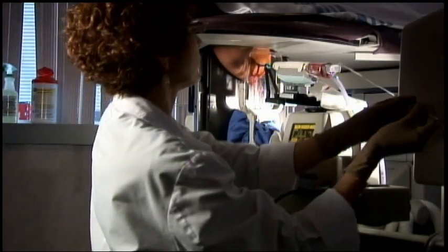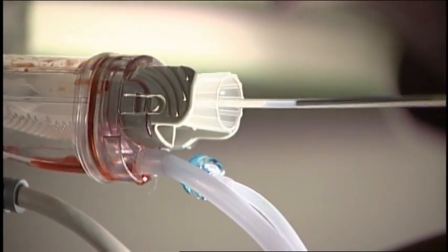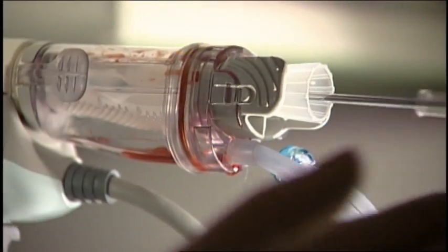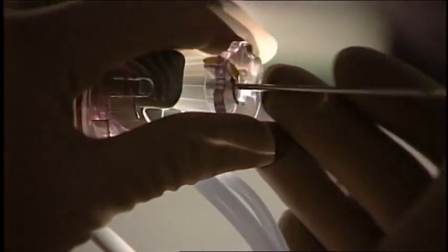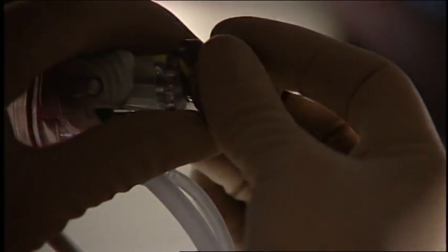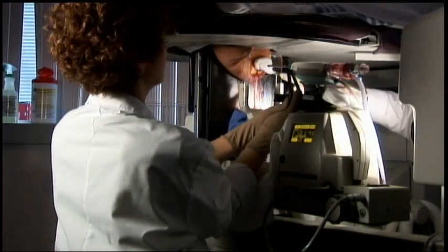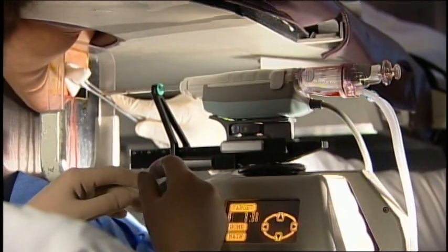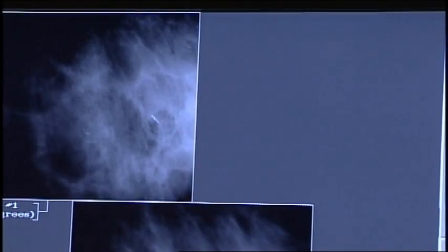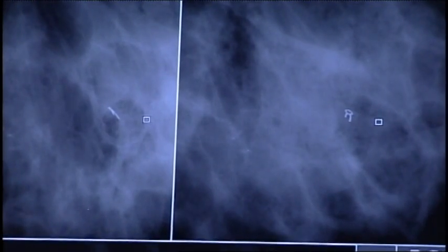Now I'm going to put the clip in through the introducer through the back of the probe. We've opened the sample notch and it will seat here. We want to make sure it's well seated and we've pulled back five millimeters prior to placing the clip. Once we've placed the clip, we're going to take another stereo pair and we show the marker that's been placed where the calcifications were.